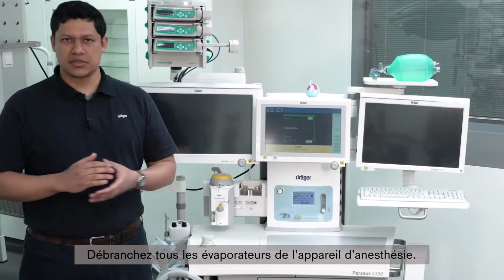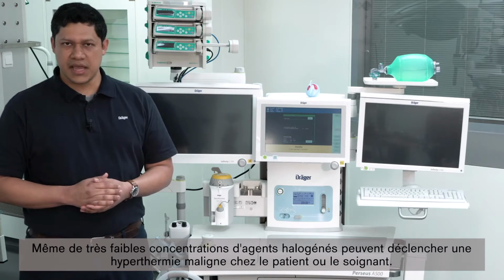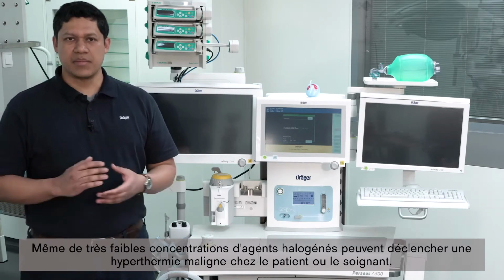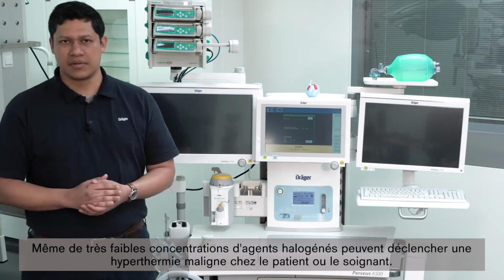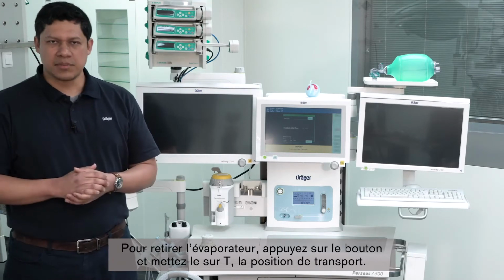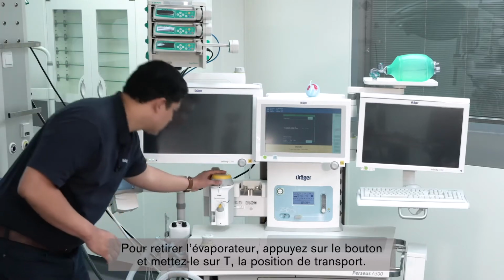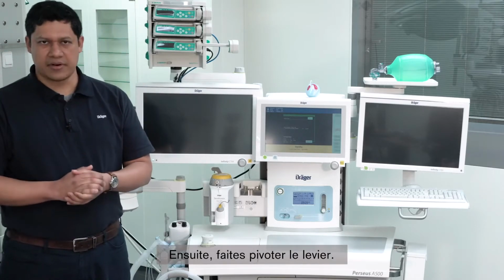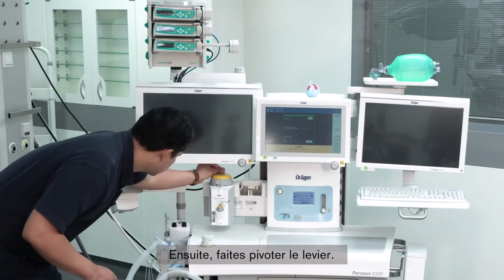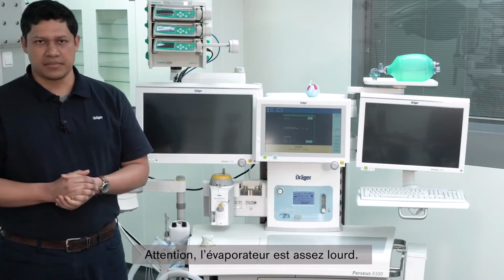All vaporizers should be removed from the anesthesia device. The smallest amount of anesthetic agent might trigger malignant hyperthermia on the patient or on the clinical staff. To remove the vaporizer, press the button and move the dial to the T for transport position. Then turn the lever. Be aware that the vaporizer is quite heavy.